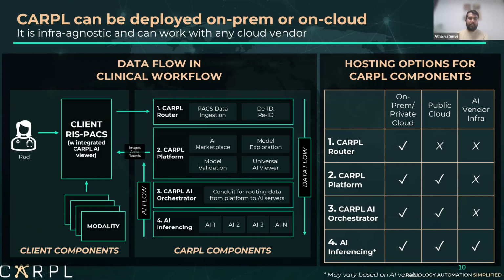for processing. So prior to data being sent out of the hospital's environment, it is completely de-identified and removed of PII before being processed via the AI application. So that is how we ensure that we maintain compliance.